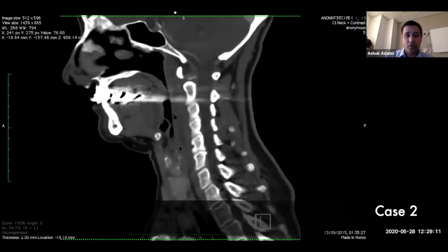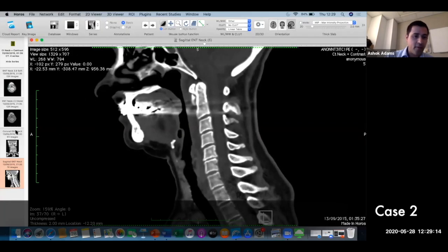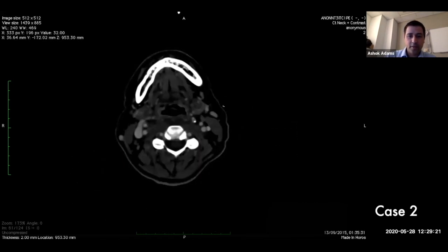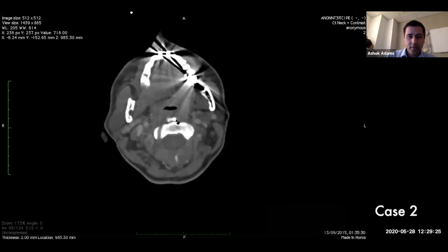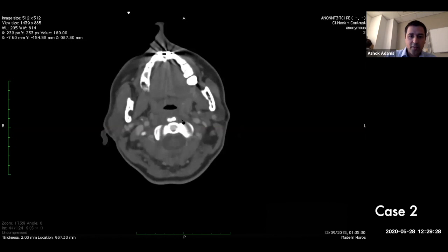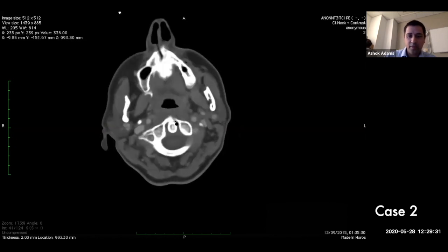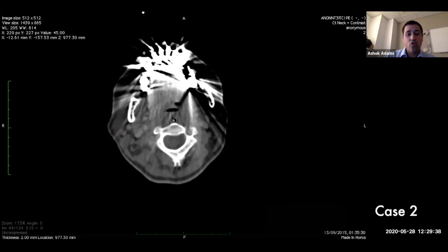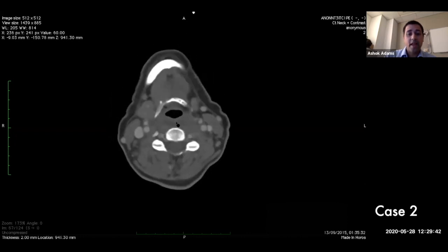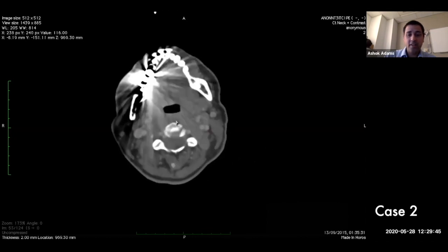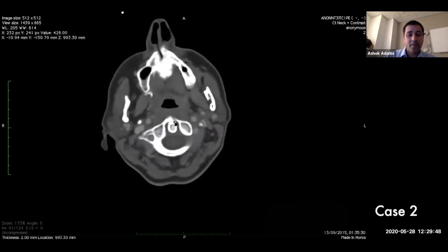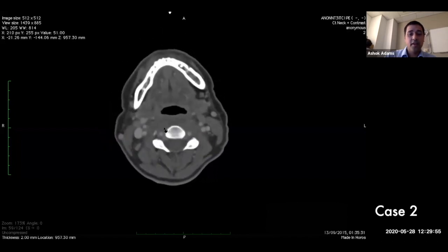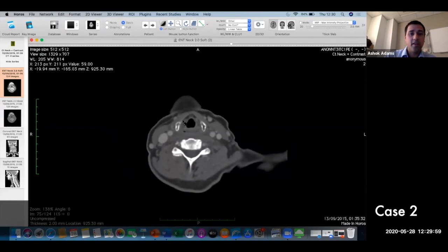There's a little blob of calcium visible. This is technically within the perivertebral space - the prevertebral muscles - a focus of amorphous calcification. This was a calcific tendonitis, which caused this prevertebral/retropharyngeal edema and neck pain. The key here is not to put a needle into these patients - it can often look like there's going to be an abscess at the back of the throat. When you do the CT and see these lumps of calcium, this is calcific tendonitis - non-steroidal anti-inflammatories and conservative management and they tend to improve.